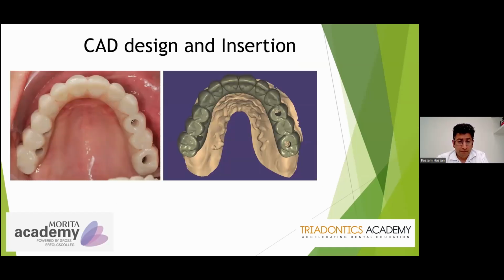This one was actually placed by my associate today. And you can see it's fitting beautifully, just like it was designed, completely digital, nothing extra was required.